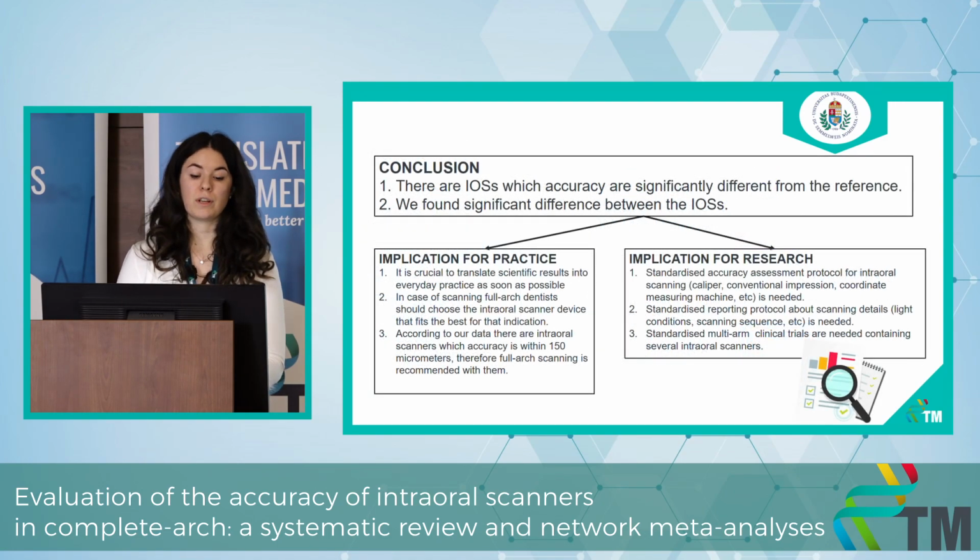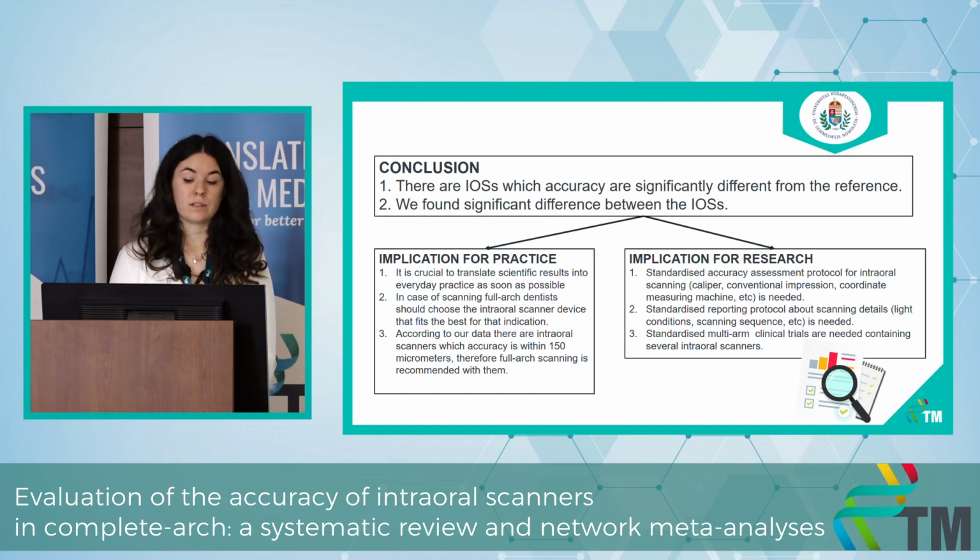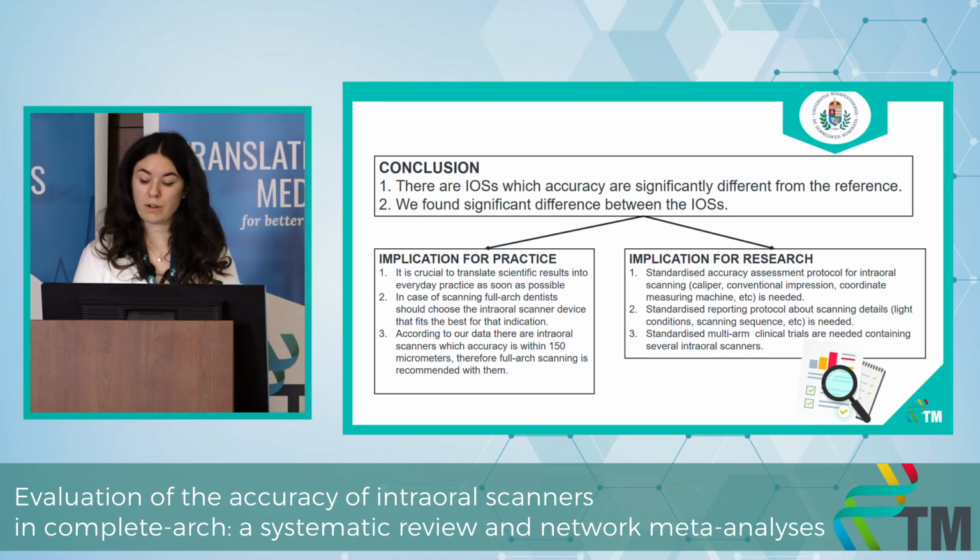As for conclusion, we can say that we found differences between the scanners, and these differences are significant, and also we found a significant difference between the reference and the intraoral scanners as well. That's why it is important to highlight that in practice we have to choose the right device for what we want to do, and also it is important in the research part to have a protocol to express intraoral scanners accuracy in the same way, so we can compare them in a better way.